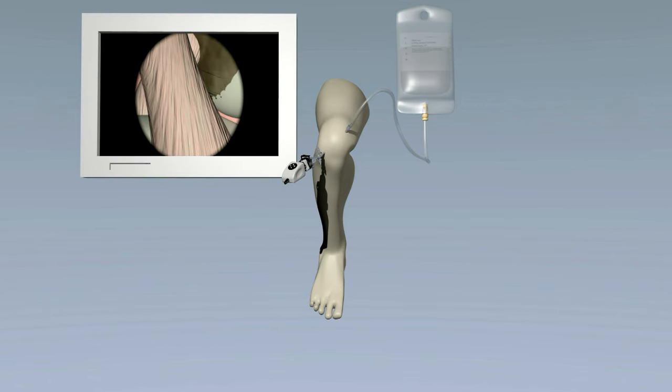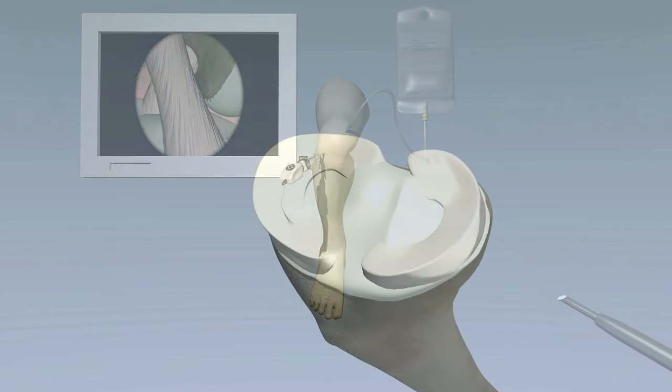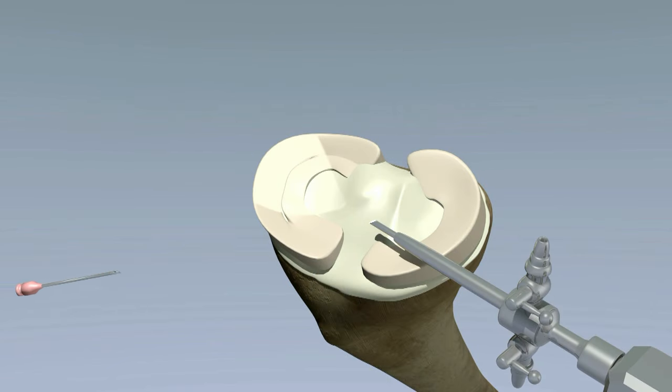Once the sterile water is flowing into the knee and the tear is well visualized with the camera, special instruments are used to pass suturing thread into the joint. The special instruments are then used to sew up the torn part of the meniscus.